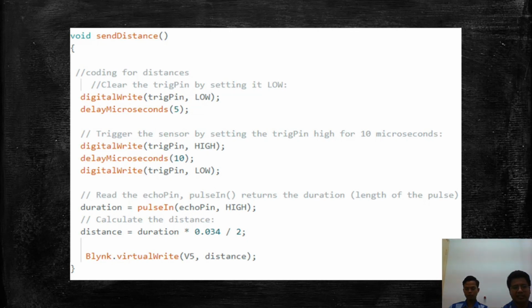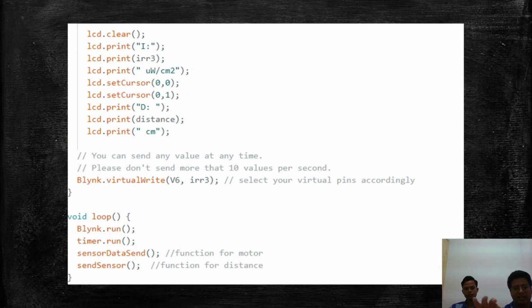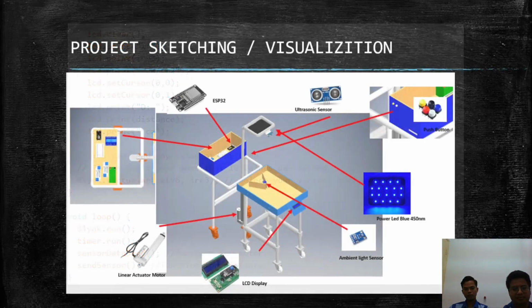Send distance is for the ultrasonic sensor, which means the coding for the calculation of distance. In void send sensor, we call for the distance value, so it will appear in send sensor. All the data will be printed and appear as output on the LCD in this function. All these functions will be called in void loop, so it is easy and smooth.